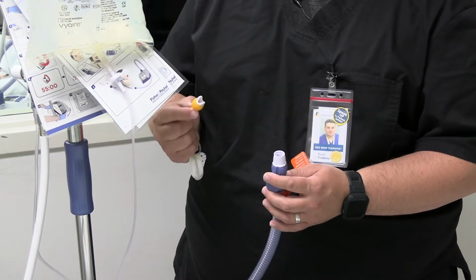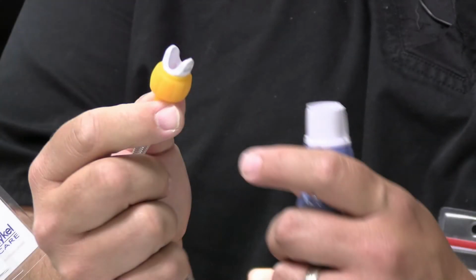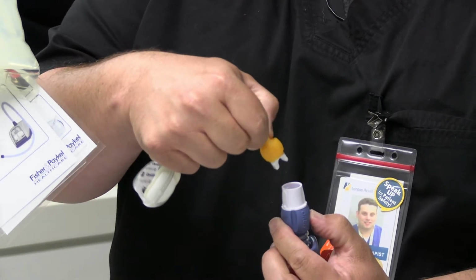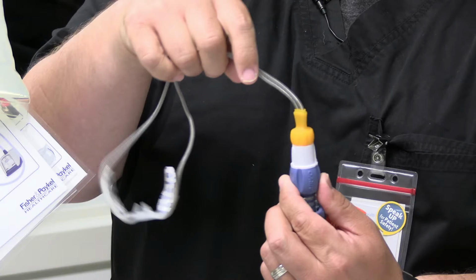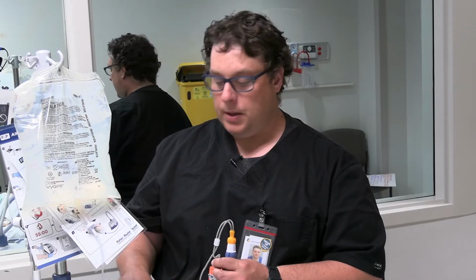Now we are going to pick our patient interface. When you take it out of the package, it has sort of a teeth-like looking connector there. And it's got little indents in there that will lock into the patient circuit. Look for those indents, and when you push it in, you'll hear a little snap. Just like that. Because we were alarming because of the leak, because we didn't have the prongs attached, it now sensed that the leak is not as high, and it notified us by that chime that we're now able to deliver the therapy based off the settings that we have set on the AIRVO currently.